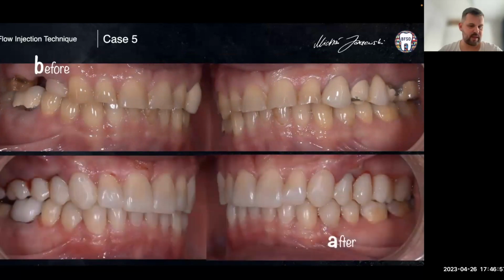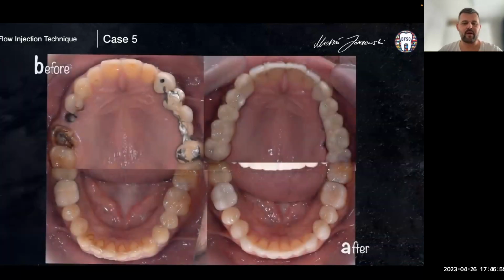In this situation, when we need to remove some teeth and we need to prepare a temporary bridge, which was also printed, we can prepare everything during one visit and change everything and make our process simple and faster.